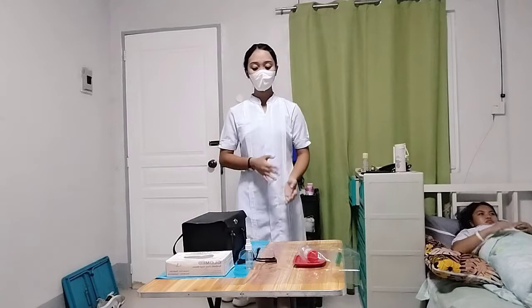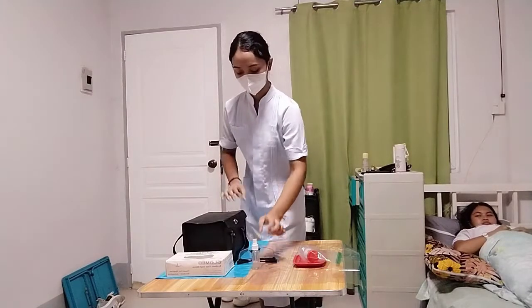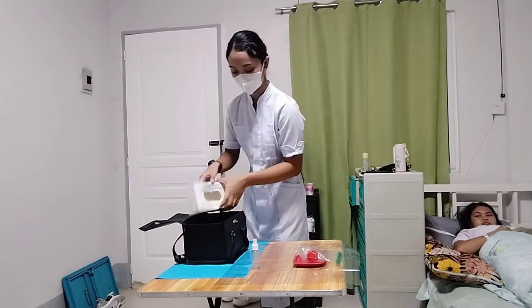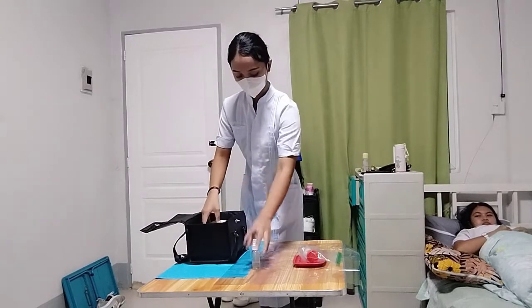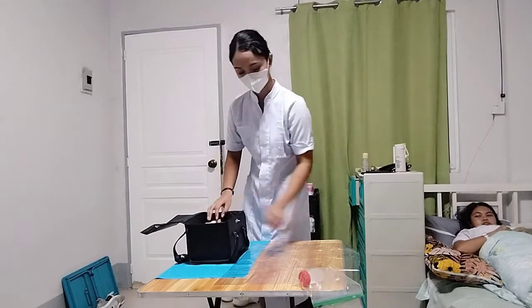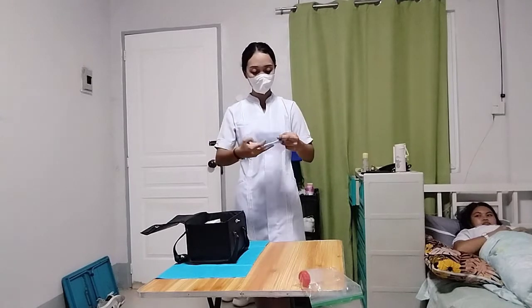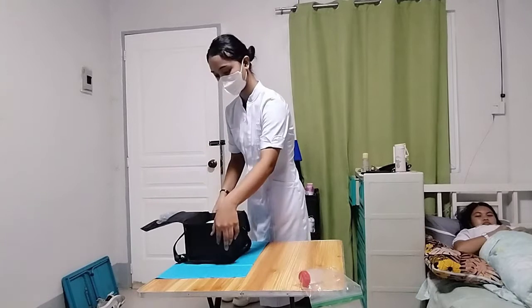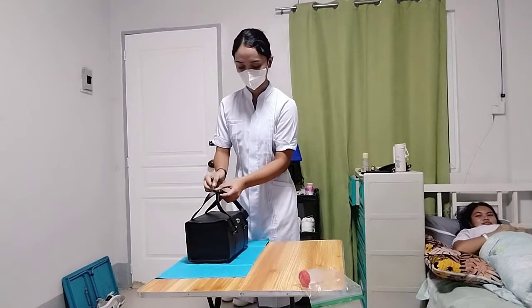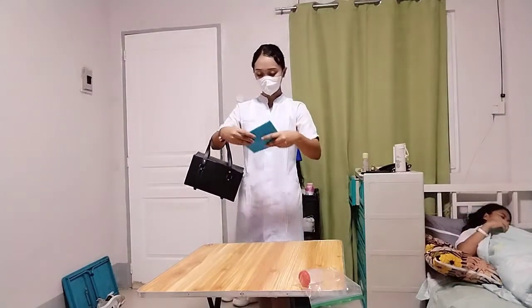Before putting back all the materials in the bag, we need to sanitize or alcoholize them. Then open the bag and put back all the materials that we needed. Fold the plastic lining properly and put it back in the bag. And then close the bag. And fold the paper lining and place it in the bag.